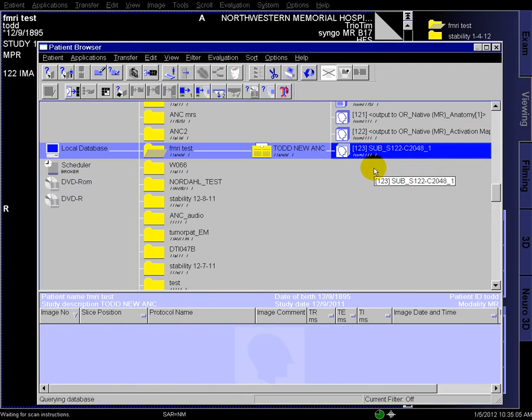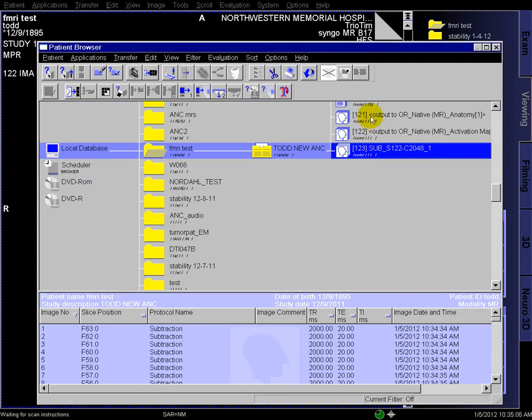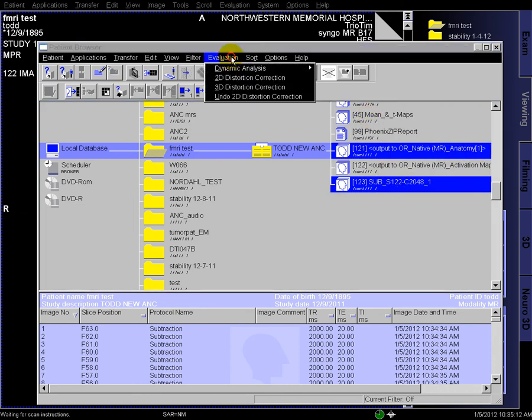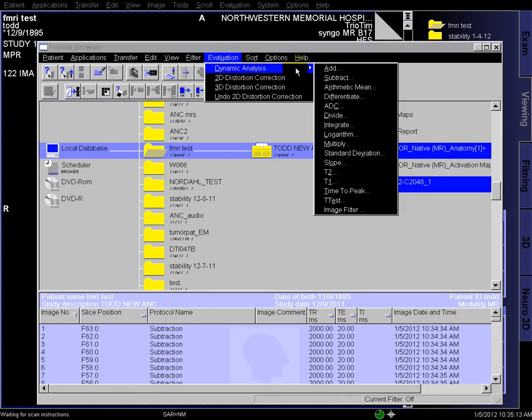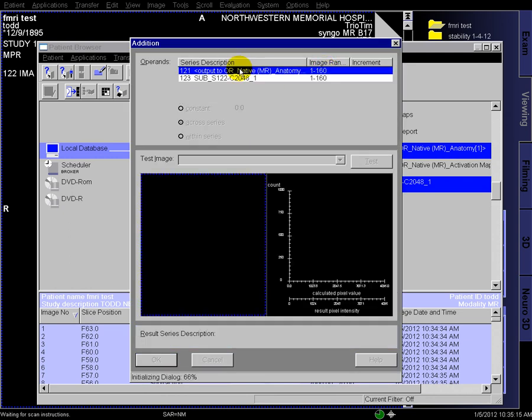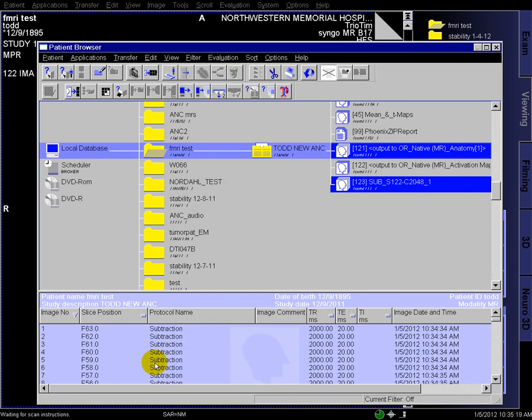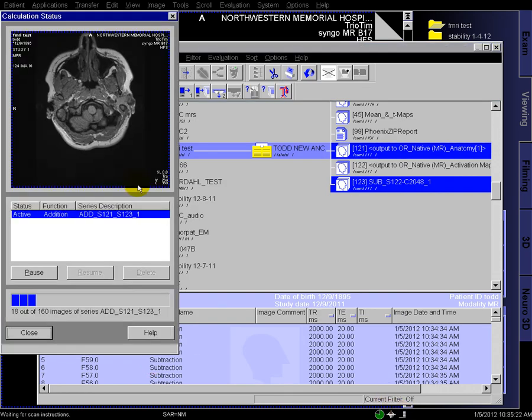So now there's our subtracted data, we can take that data and the anatomy data and add those two together. They're co-registered, so we know we can just add them right up, and the maps will be in the same place as they were in the Neuro 3D tool.